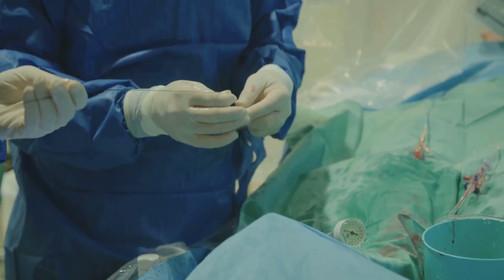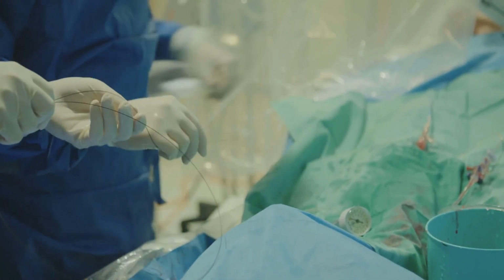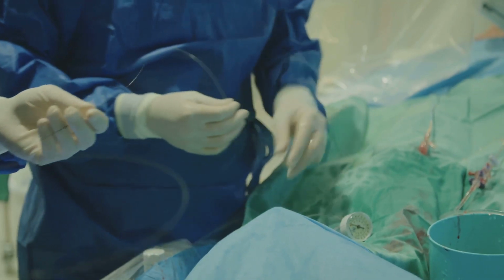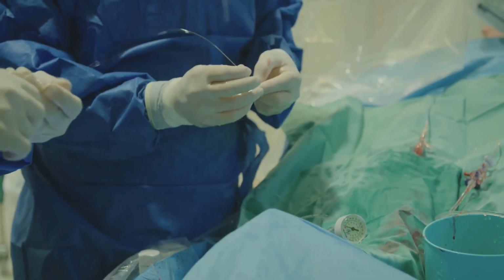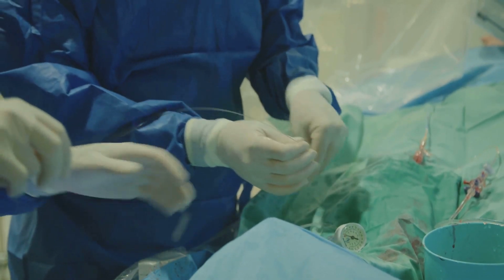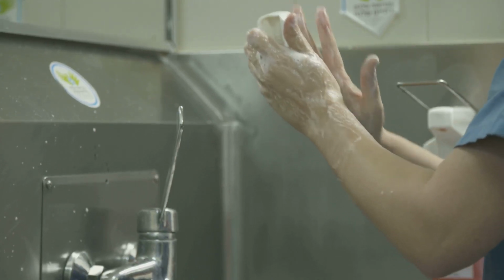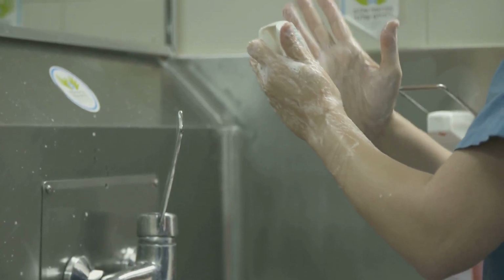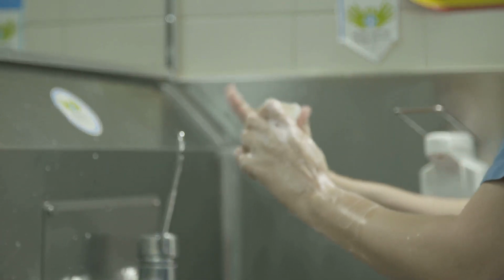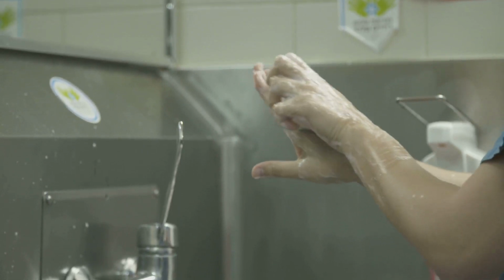Catheter blockage, the first problem we discussed, can be a significant hindrance to the smooth functioning of a catheter. However, with regular and meticulous cleaning, coupled with the use of appropriate lubricants, this issue can be addressed effectively. Next, we tackled the issue of CAUTIs, a common and potentially serious complication. We emphasized the importance of stringent hygiene practices, the use of sterile equipment, and the prompt recognition and treatment of infections to combat this issue.